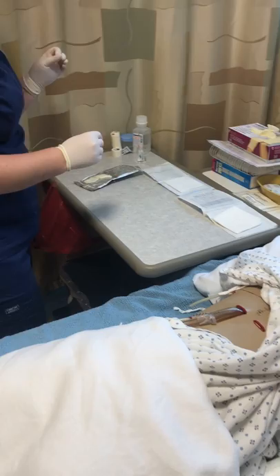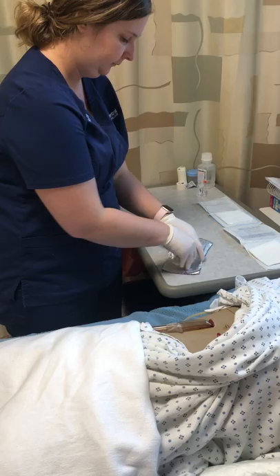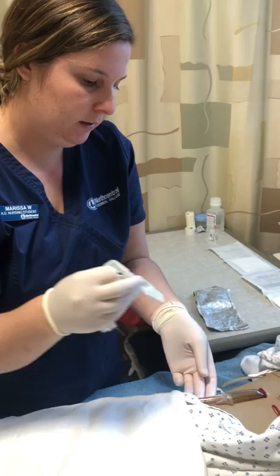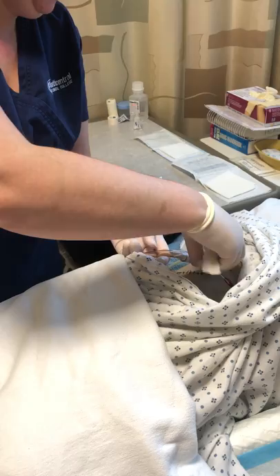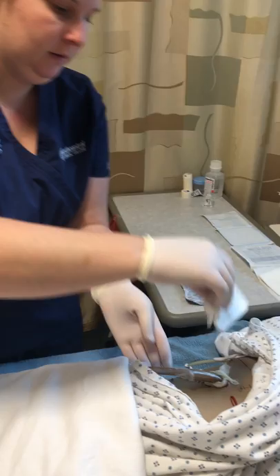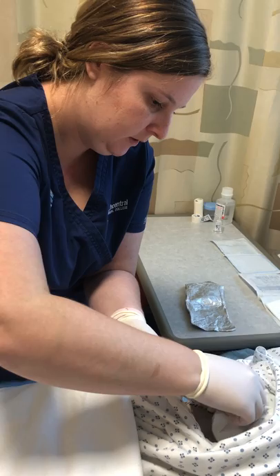All right, so then I'm going to grab my Vaseline gauze here. I'm going to make this my clean hand and this my sterile hand. So I'm going to grab the tube and put my Vaseline gauze around the dressing there. And then I'm going to grab my 4x4 gauze, keeping sterile technique.